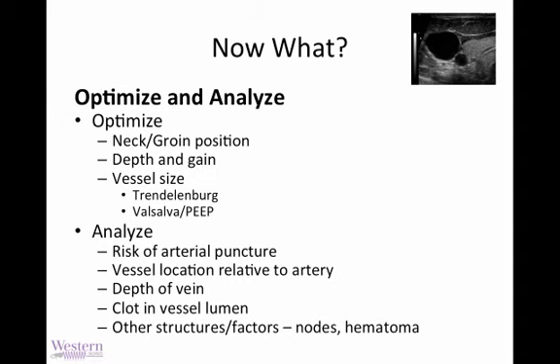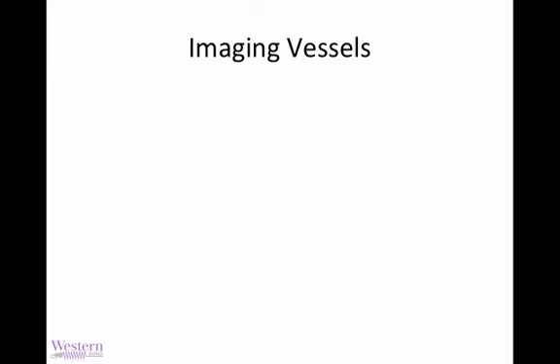And as mentioned, you want to analyze and look for pitfalls or hazards along the way. Of course, the advantage of being able to see before you stick anything in people is you can have a good look around and look for these kinds of problems.